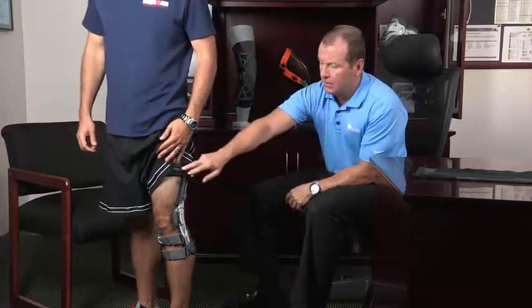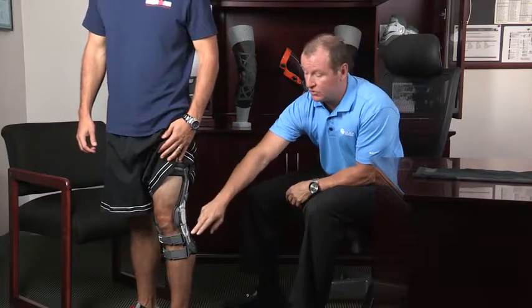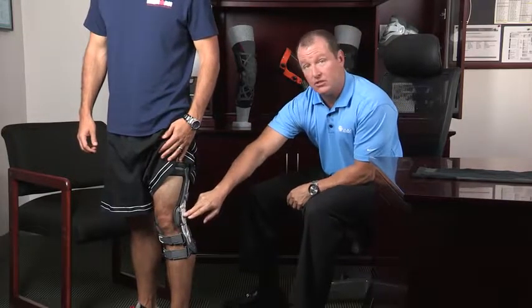When you combine the frame design of four points of leverage reducing strain on your ACL, in addition to the hinge keeping you out of that at-risk zone, you've got a great level of technology to help protect against ACL injuries.